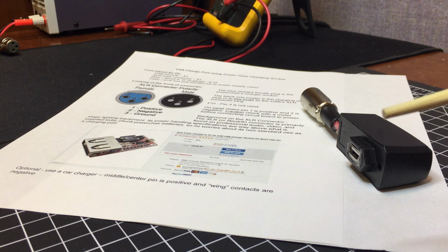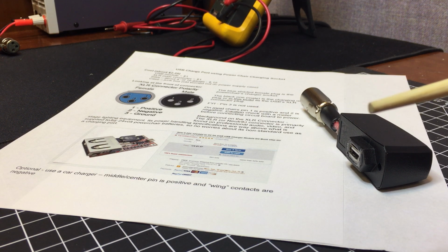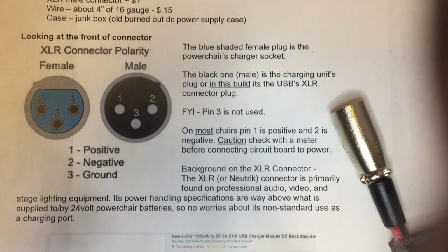Just hot glue everything in, cut holes, a little bit of wiring, hot glue, soldering. I'm not going to show you the soldering. It's pretty straightforward. But anyway, as far as the connectors, I'm going to go ahead and just give you the sheet. I'll try to put it in the notes too. But those are the pinouts.